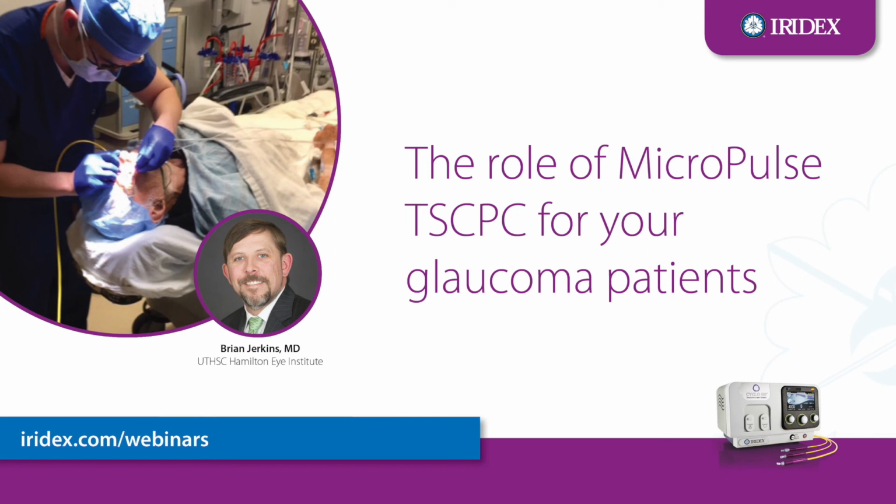Excellent. The next question is concerning cycloplegia. So do you cycloplege your MicroPulse patients, and vice versa, would you also cycloplege your continuous wave patients? I actually don't do any cycloplegia on any of my patients for this. Okay, very good. I know that historically for continuous wave, there was the use of cycloplegia to help them. But I agree, for MicroPulse, I have not seen people cycloplege. Correct.